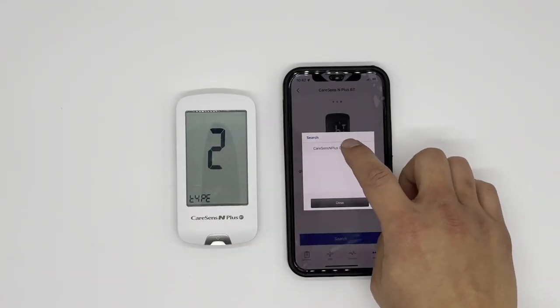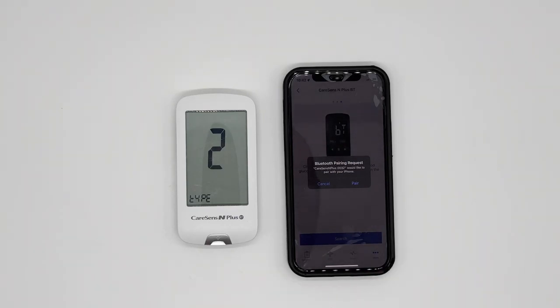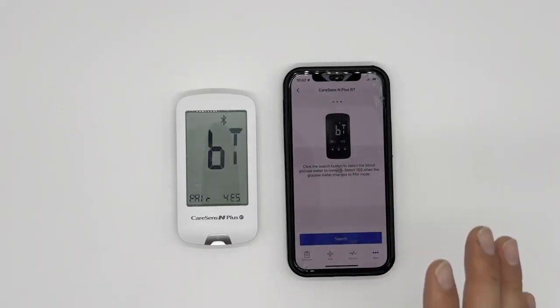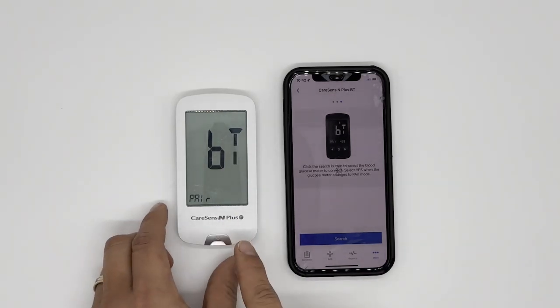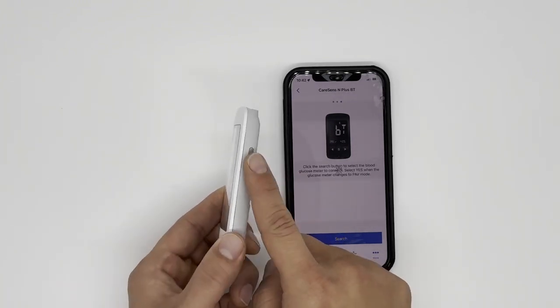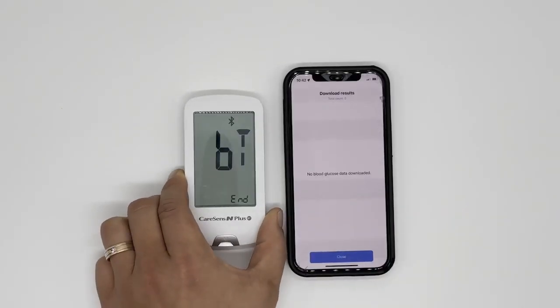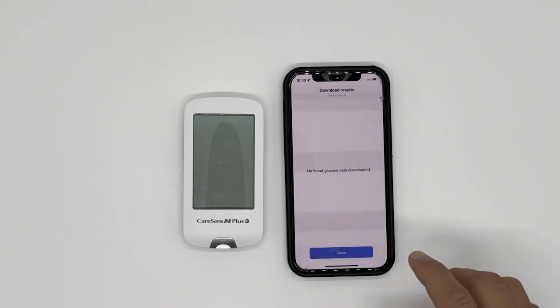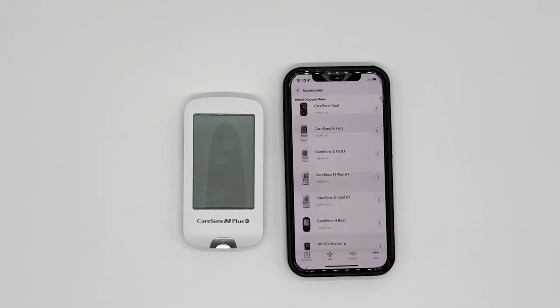That four digits is the last four digits of the serial number on the back of your meter. Click that. Then you'll see a screen — press Pair. We're not done yet. Press Pair. When you see the screen showing BT Pair — Yes — this is a very important step. Press the power button on your meter. You'll then see BT Sync End. This screen shows up if you don't have any blood glucose data on your meter; if you do, you'll see other results on your phone. It is now successfully paired.